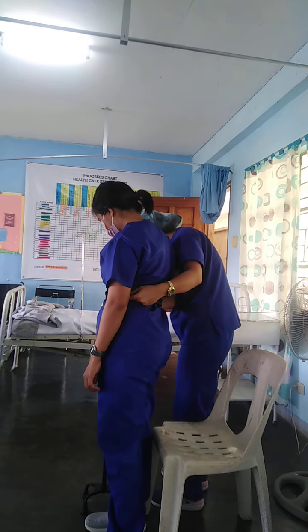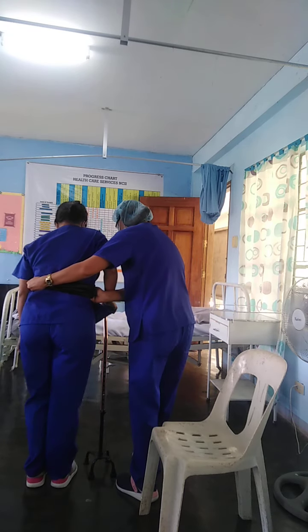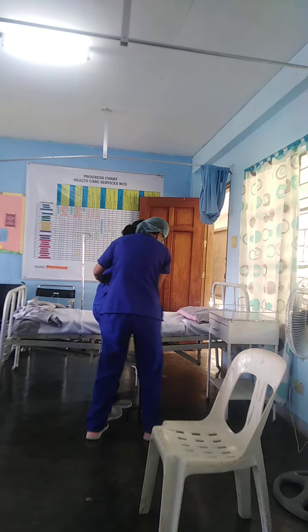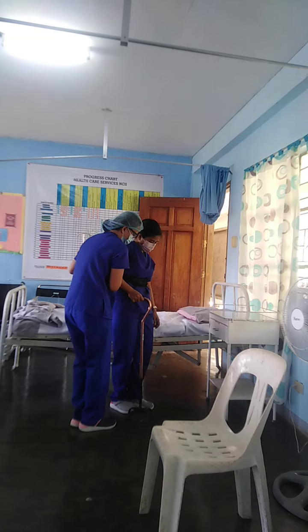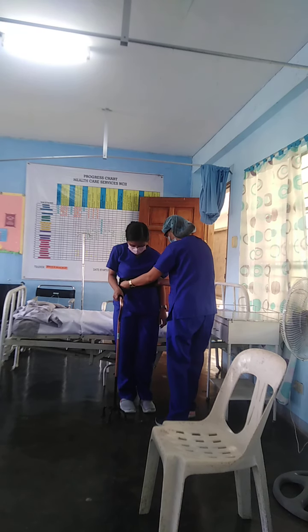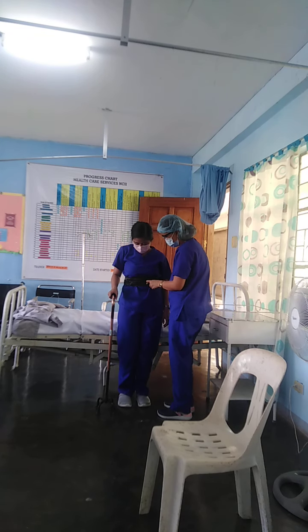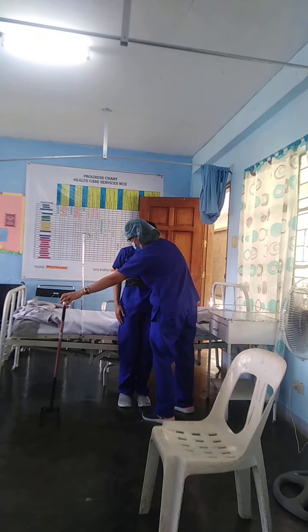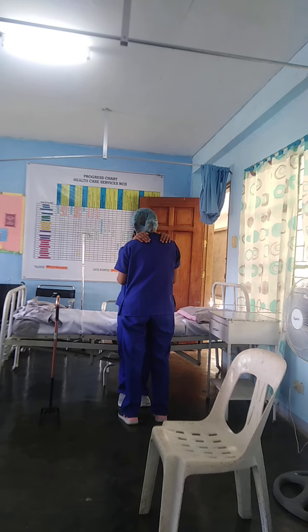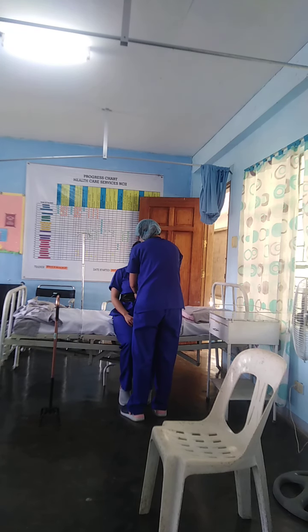Cane and key, then followed by the weaker leg. One, two, three. Ma'am, very good. Ikot po tayo, ma'am. One, two, three. One, two, three. One, two, three. I'm ready to go.